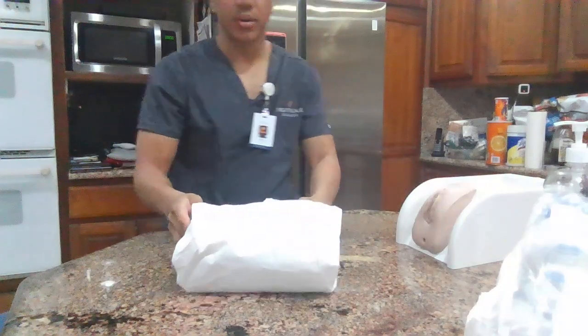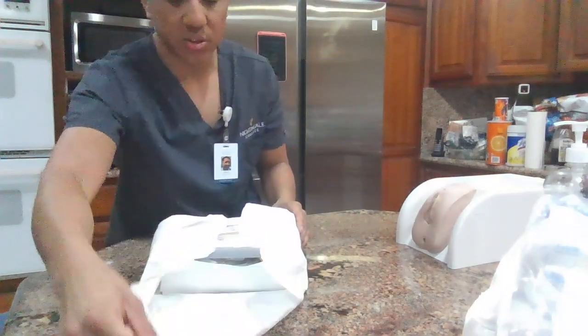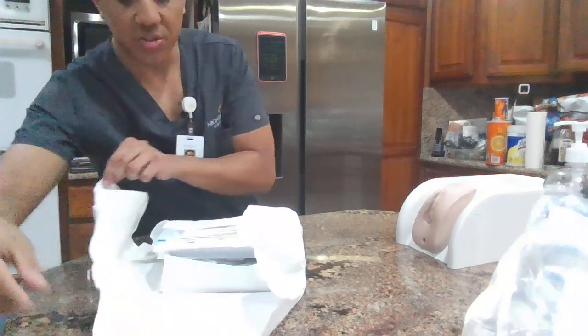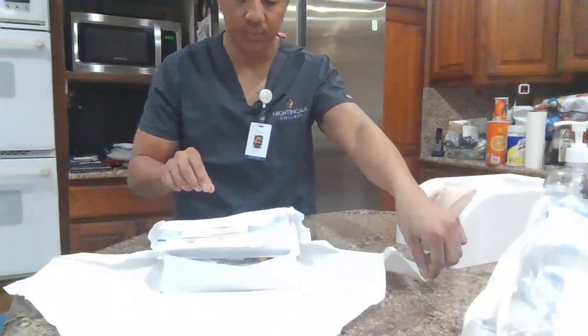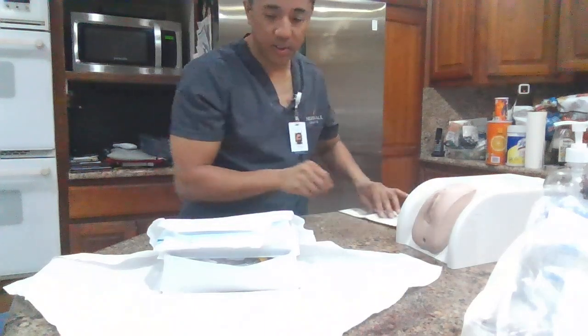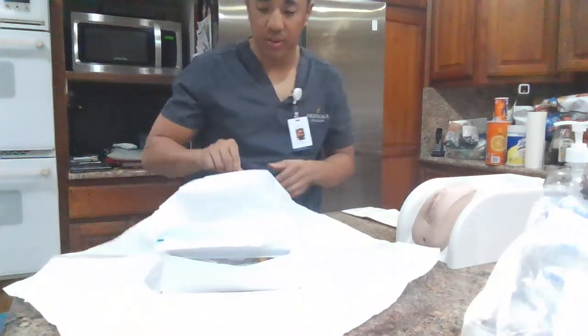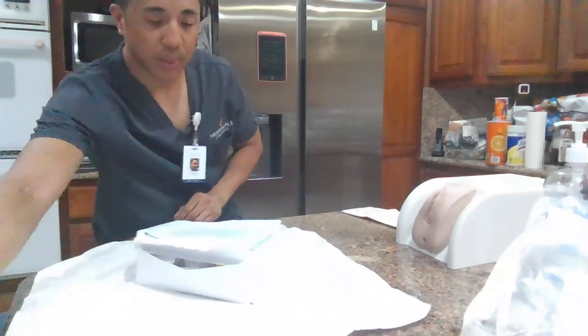Using sterile technique, I'm going to open the kit nice and slow, only touching the 1-inch margins of the sterile kit. I'm going to take my gloves and place them on the side. I'm going to finish opening up my sterile kit, just like that.